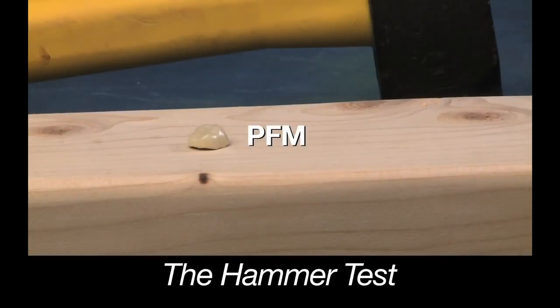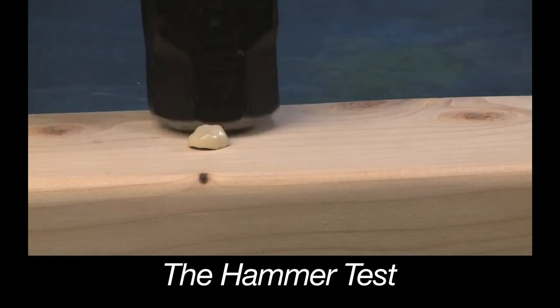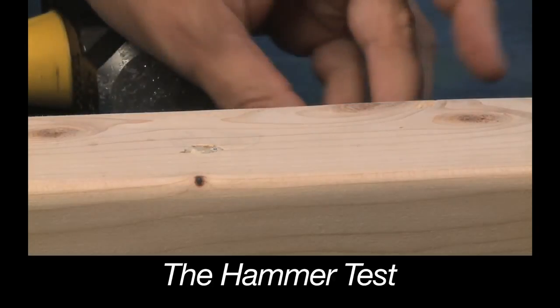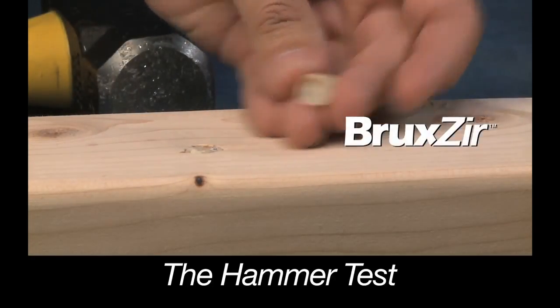Need more proof of Bruxer Zirconia strength? Compare with a typical restoration made with porcelain fused to metal. Now the Bruxer restoration.